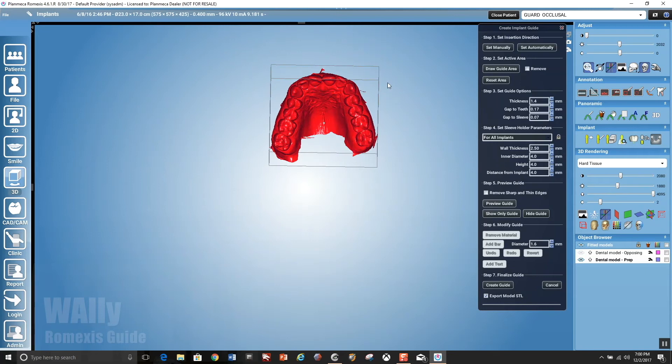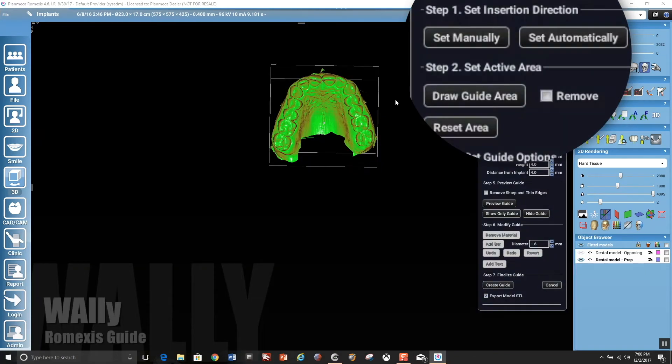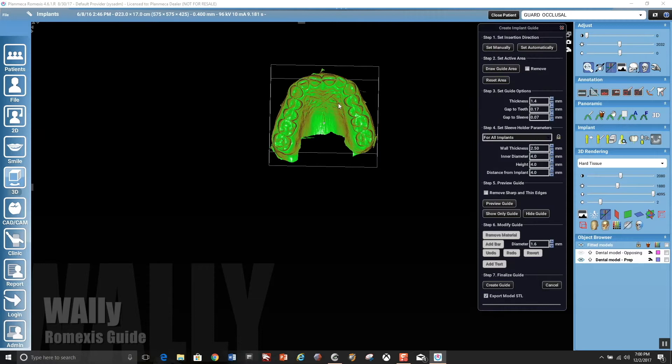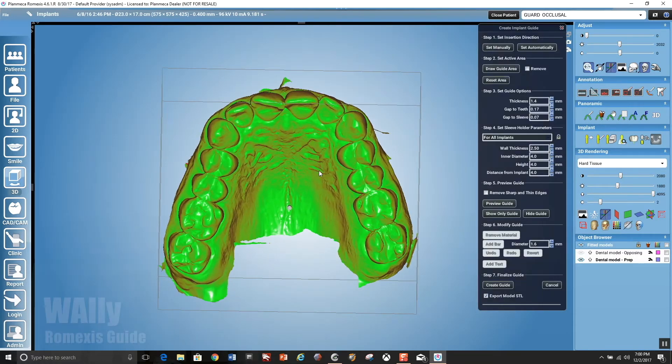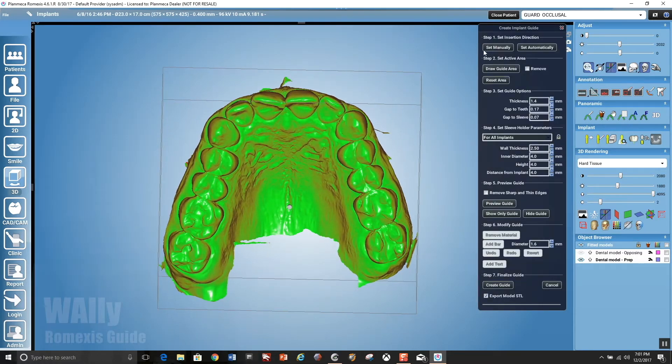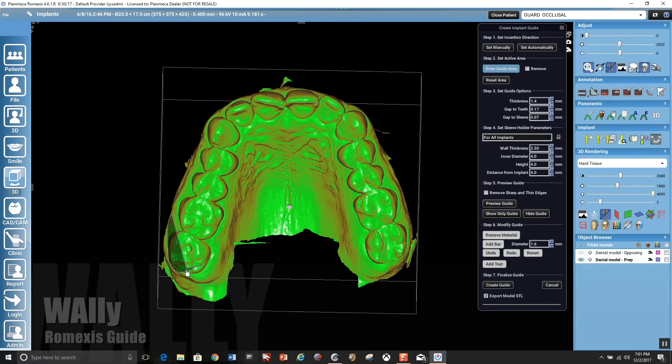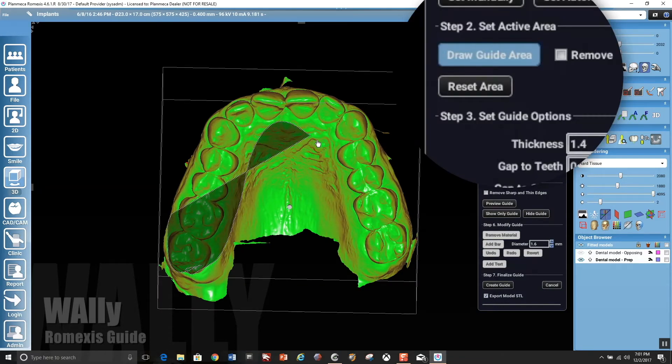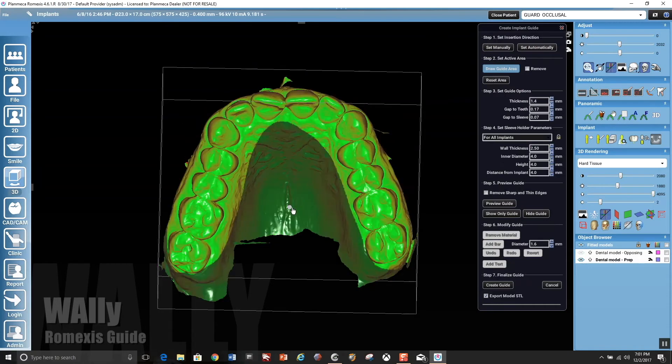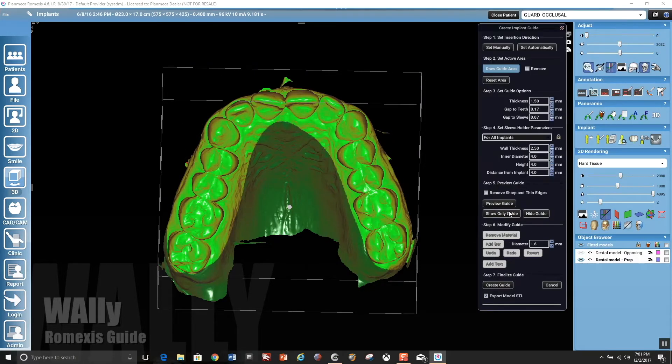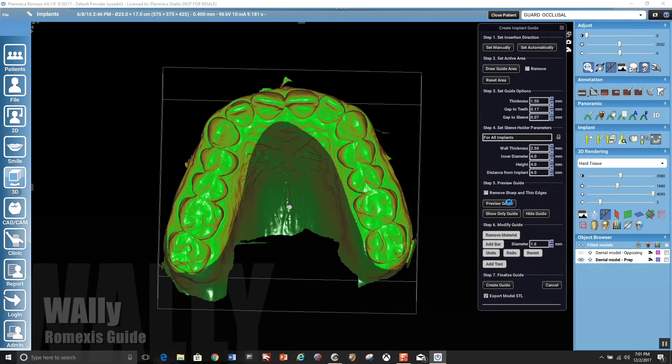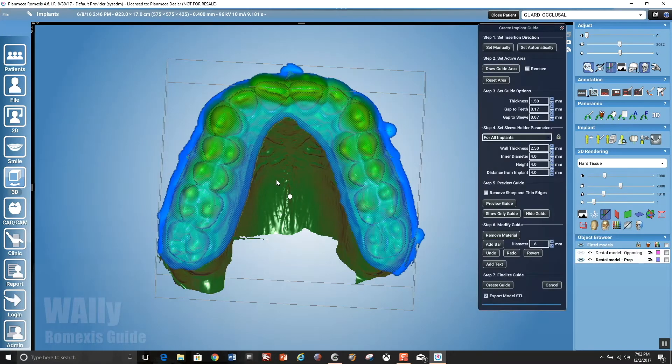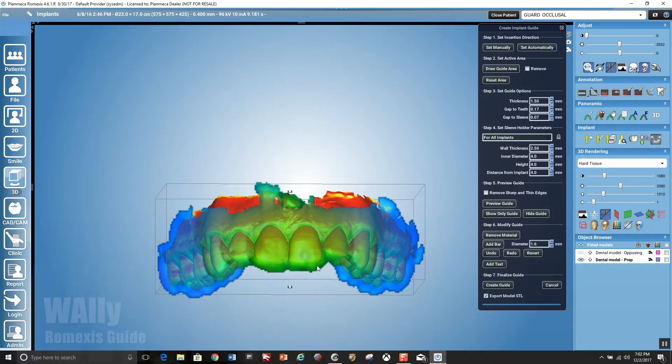So then you open the guide module, and you're going to set your path of insertion for the occlusal guard manually, and it will highlight severe undercuts as red. And then you're going to draw the guide area. You just circumscribe a little bit past where you want the guide to go. And then you could set your thickness. In this instance, I wanted one and a half millimeters. And then you preview guide, and it's going to render that over the model, and it is anatomical.